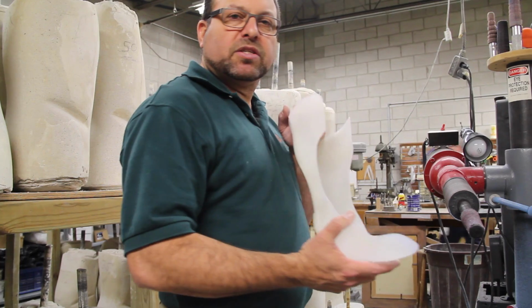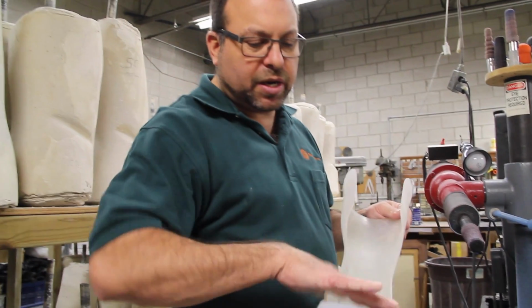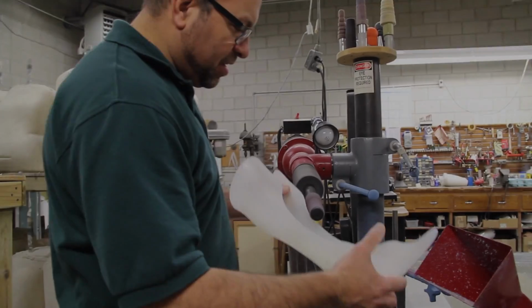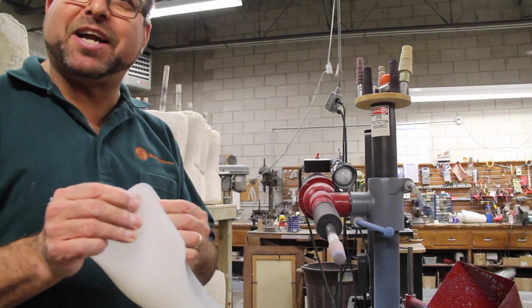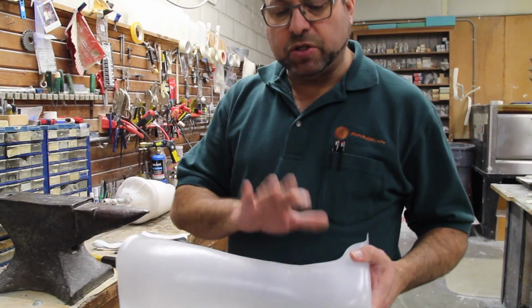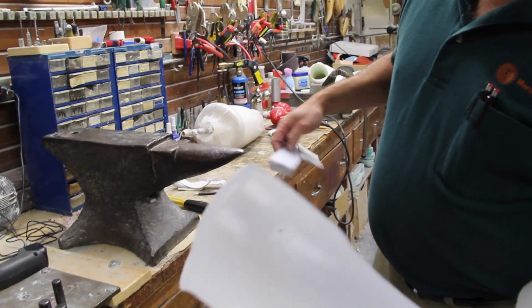We've trimmed out the plastic off of the cast. We have to finish fabrication. We begin by grinding up and smoothing up the lines, and then we'll buff them to a fine finish. Okay, now that we have the finished product, all we need to do is add the 2 straps. The final part of the fabrication is just adding the calf and supramalleolar strap. We'll just rivet them on with speedy rivets and we'll be set. We'll be ready for the patient.